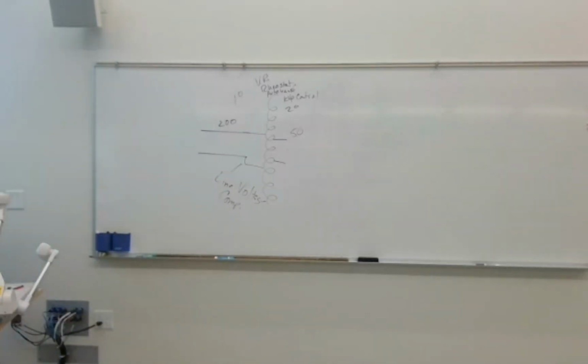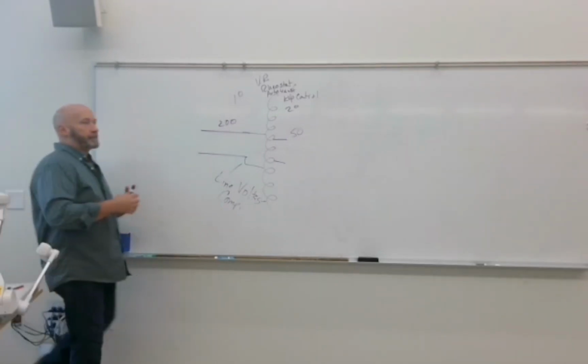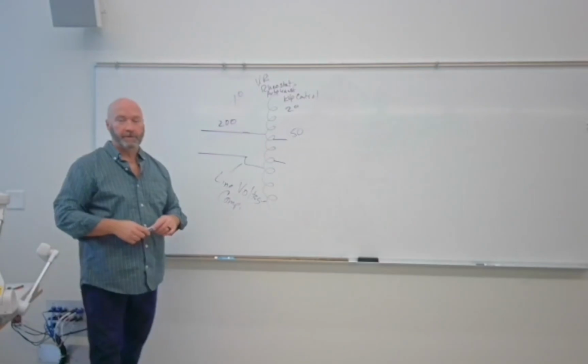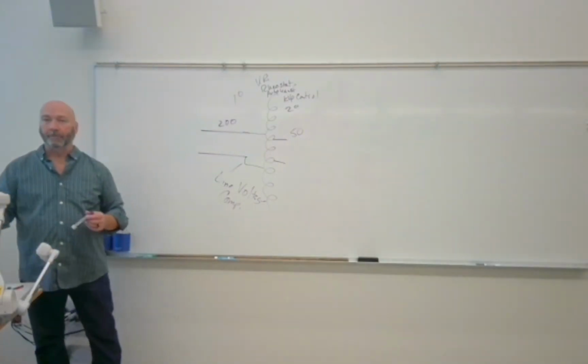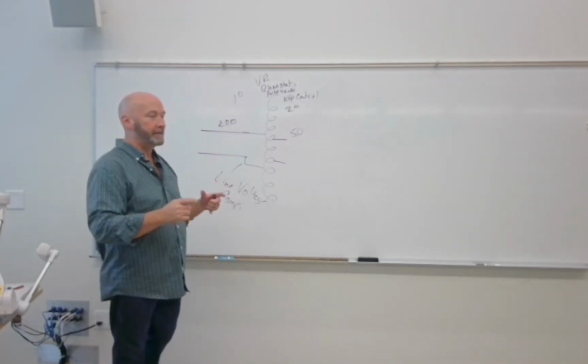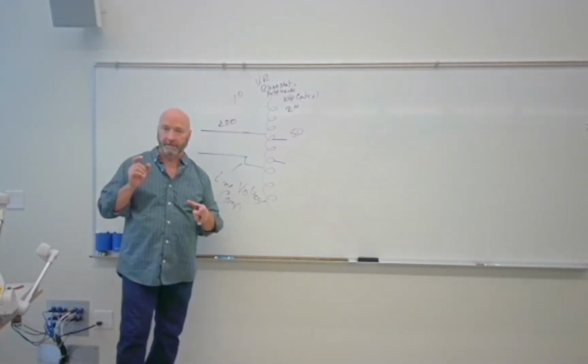So we've got the line voltage compensation. We've got the autotransformer. If you look on page 99, it talks about the different major and minor kVp adjustment. You don't see that anymore. The only time you're ever going to see that is if you're working with a single phase machine.